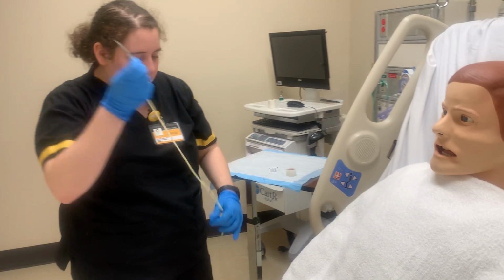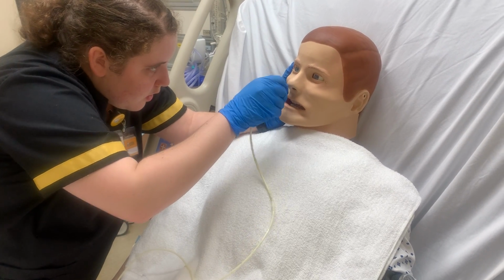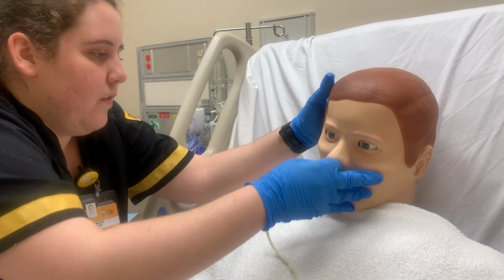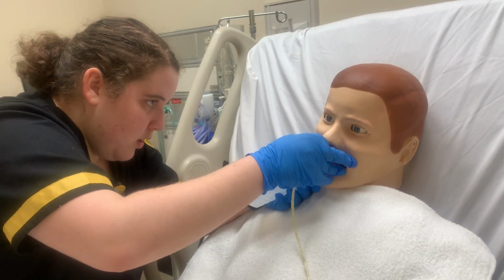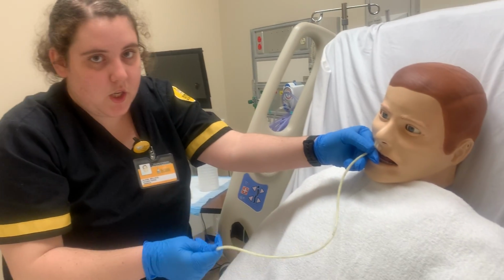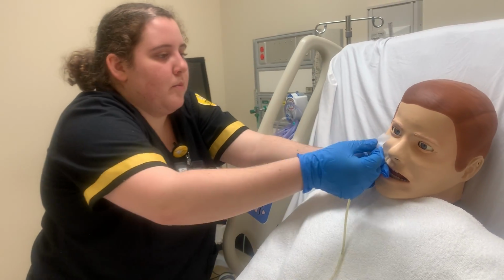Great, so now we're going to get started and I'm going to ask you to tilt your head back so I can get this in. And now that there's some resistance, I'm going to have you tilt your head forward and drink some water while I get the rest in. Great. And normally we would go down to where we marked it, but because it's a mannequin, it's not going to go that far. So we're just going to tape it here and go from there.